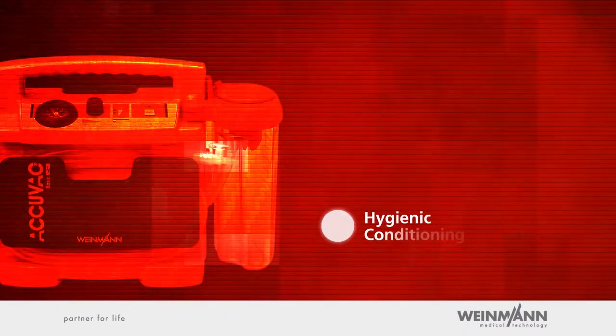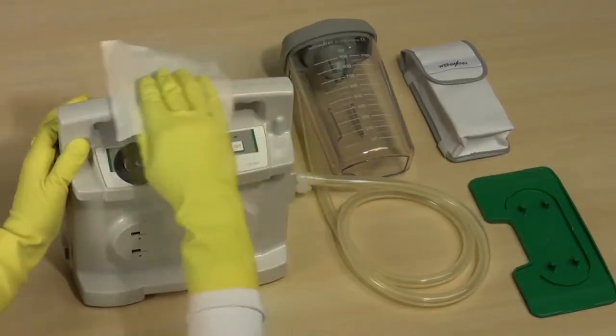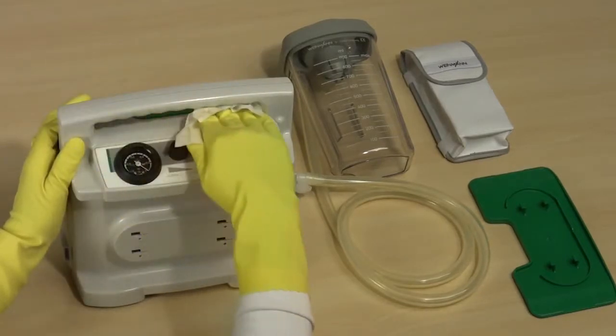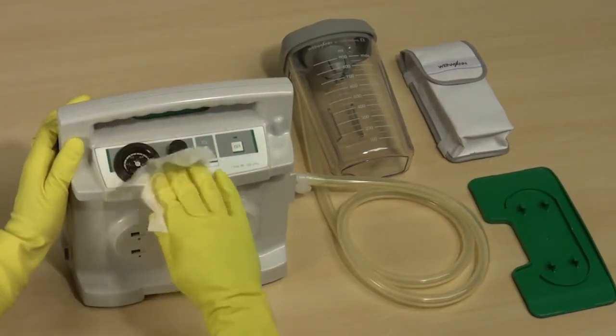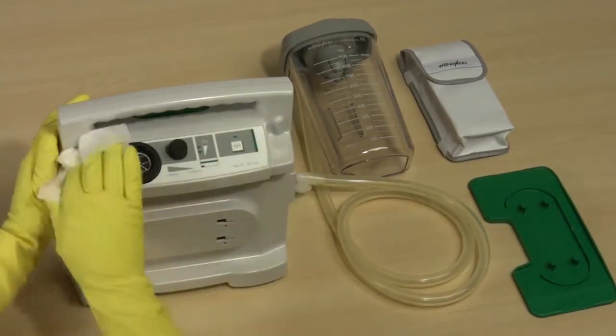Hygienic conditioning. The AcuVac Basic motor unit can be cleaned with a wipe disinfectant. However, before you use the disinfectant, use a moist cloth to remove all visible contaminants from the surface.